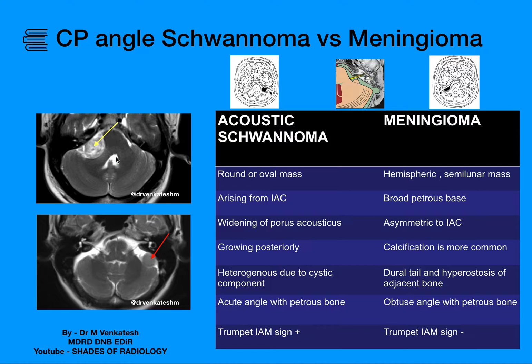Here you can see two examples. It's a straightforward case of acoustic schwannoma. You can see mild widening of the right internal auditory canal and a soft tissue lesion which is heterogeneous signal intensity in the right CP angle. Left CP angle is normal. The lesion is causing compression over the cerebellar peduncle and pons.